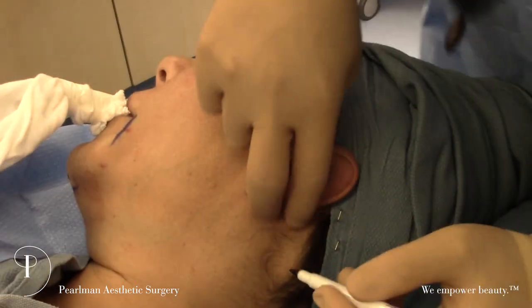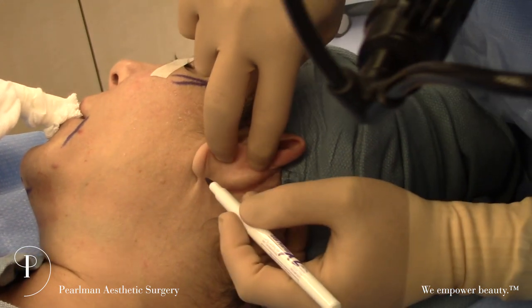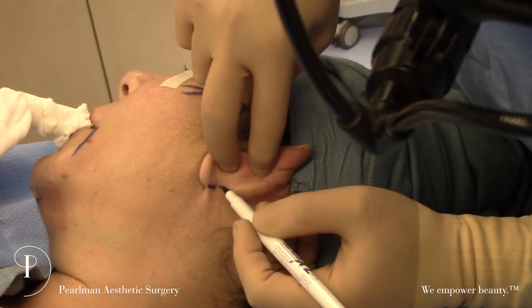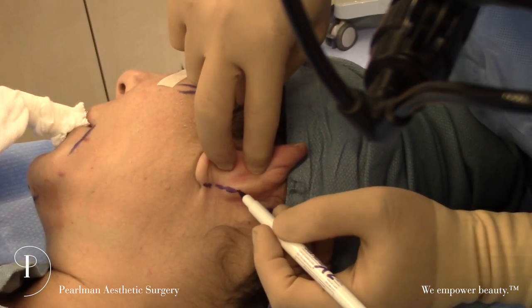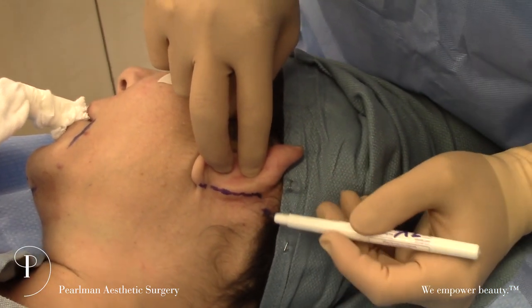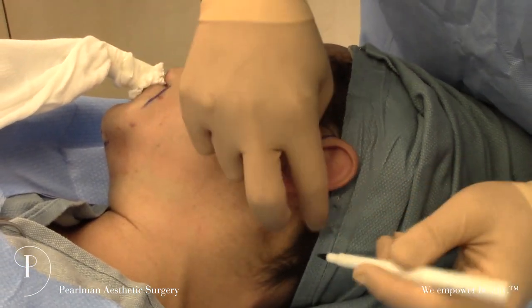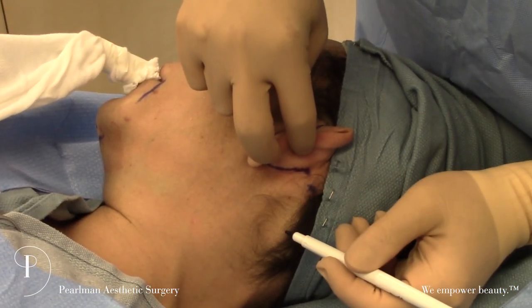Then we come down in front of the ear. The touch point is here. We come up just a little bit on the ear — not a lot — because the incision will migrate backwards. She does not have a lot of skin to go, so we may not need to do this limb. For younger patients, we can get away with what's called a short scar facelift.